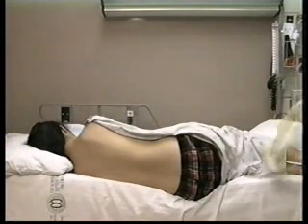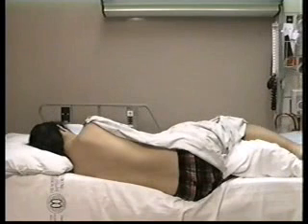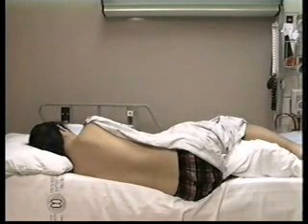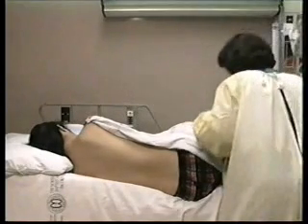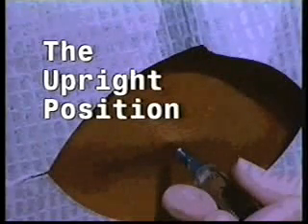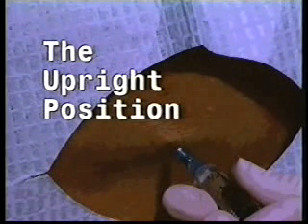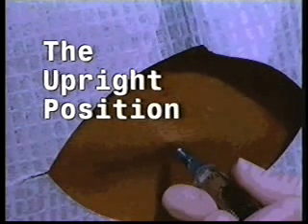Pillows can be placed between the knees to assist in keeping the iliac crests aligned. Double check to make sure you have everything you need. Have the patient draw his or her knees up to the chest to widen the spaces between the spinous processes. The advantage of using the upright position is the ease of access to landmarks with minimal need for patient cooperation. Patients who are obese or have breathing disorders may benefit from this position.